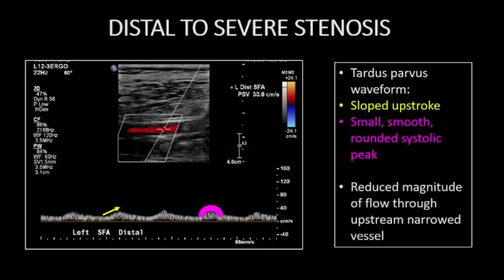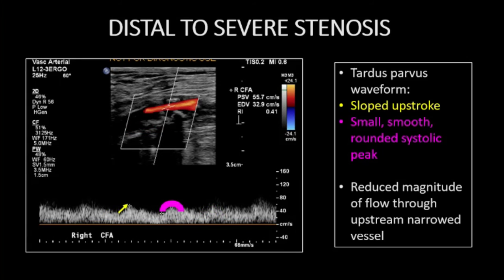Distal to a severe stenosis, the classic tardus-parvus waveform may be encountered. This is characterized by a markedly sloped upstroke with a small, smooth, and rounded systolic peak. Findings reflect severely diminished degree of flow through the narrowed upstream arterial segment. This next tracing is a little noisier, but again demonstrates tardus-parvus characteristics. Keep attention out for this classic waveform.